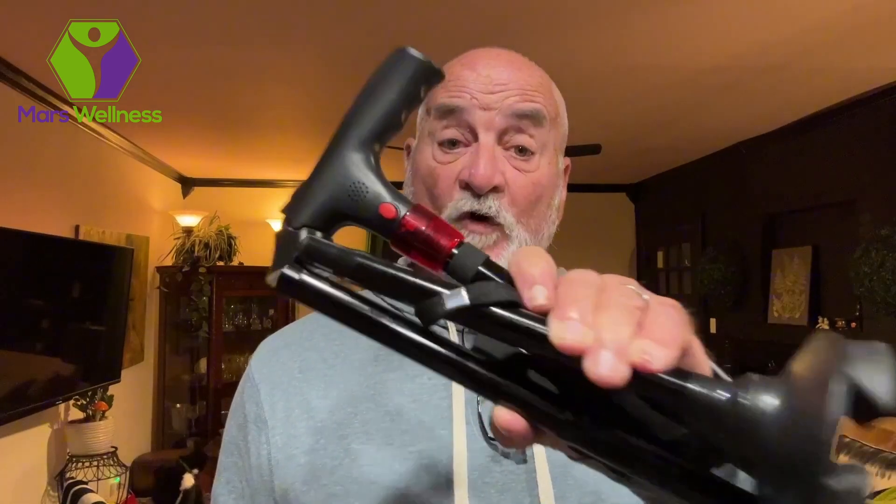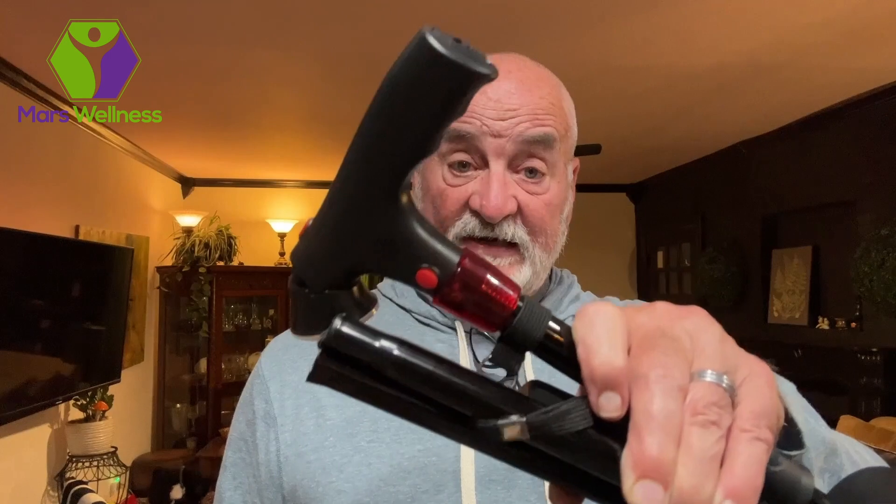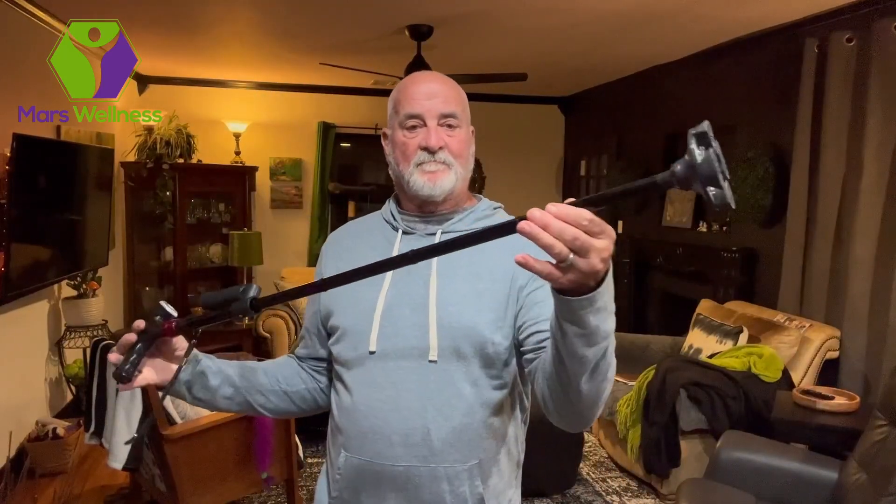I want to show you the ultimate companion for your mobility needs. It's the folding adjustable cane with LED light. Easily unfold it with a simple flick and you're ready to go.